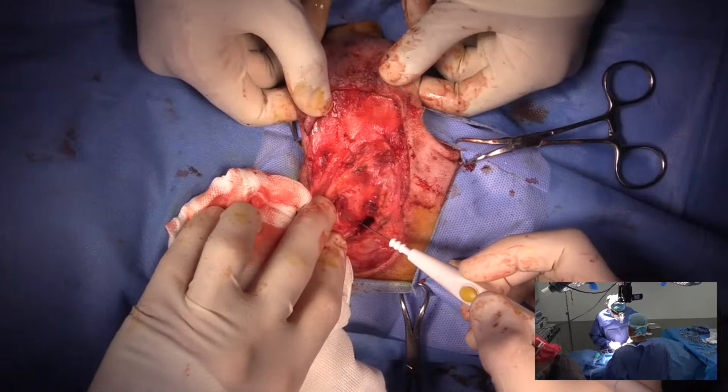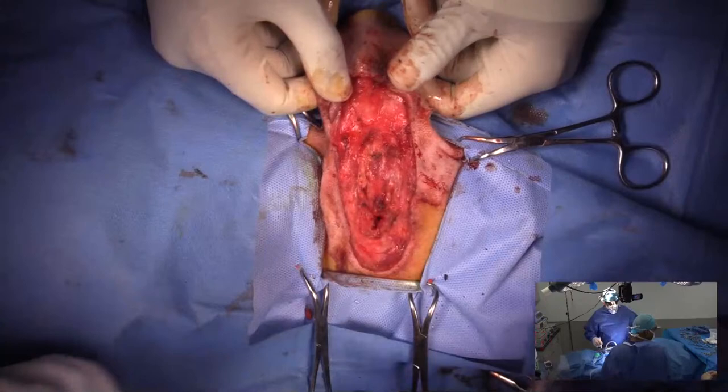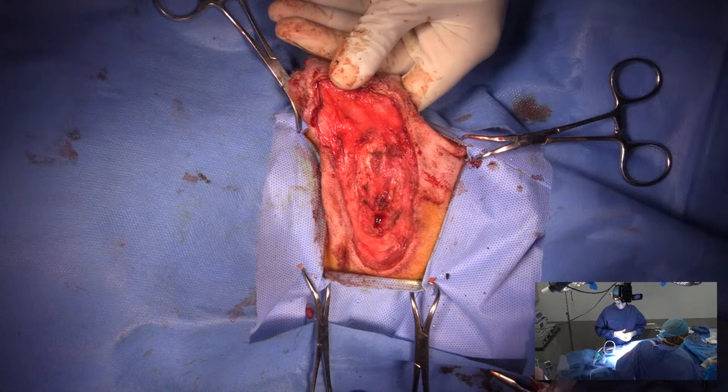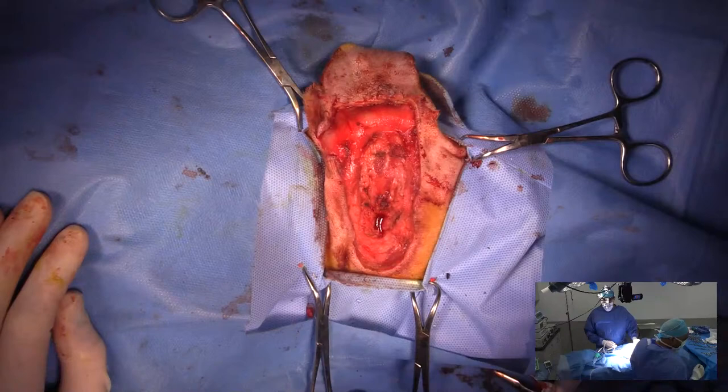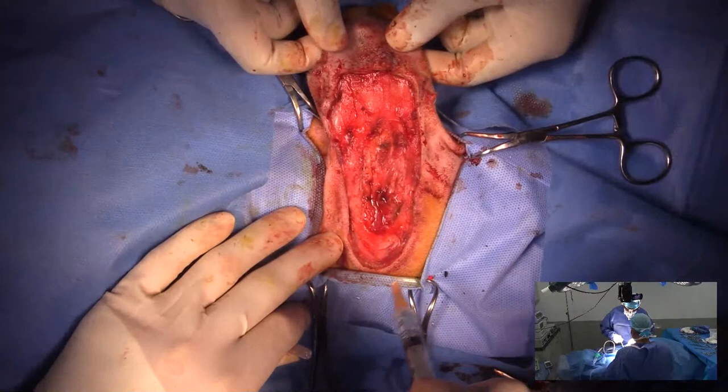There's a big branch of the facial nerve right there, right next to what I'm about to cauterize. I'm just waiting now for my mepivacaine. And I just do a splash block on these guys, which means that I just squirt mepivacaine topically. And then I'll get some 3-0 PDS, please.